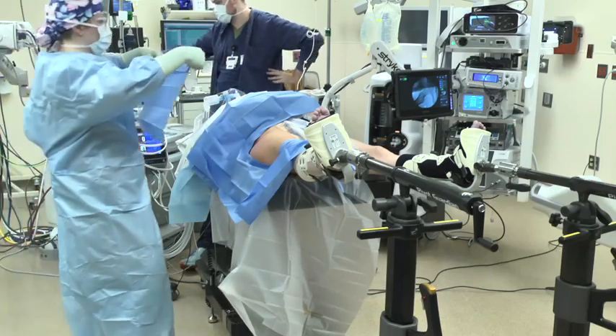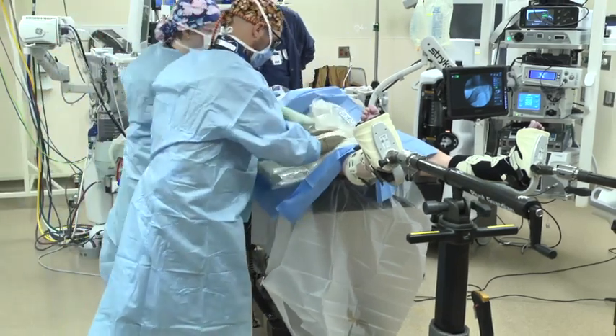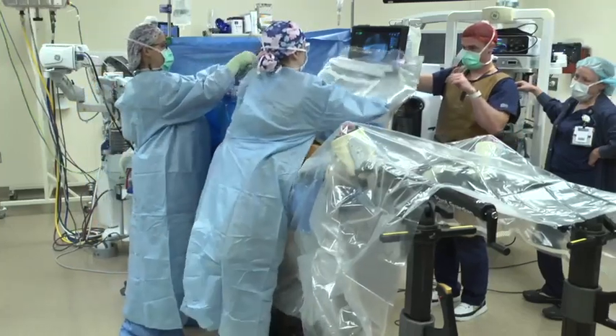The operative field is then prepped and draped. A shower curtain is applied and a bar drape provided to protect anesthesia from the operative field. The Stryker hip check monitor is then draped.